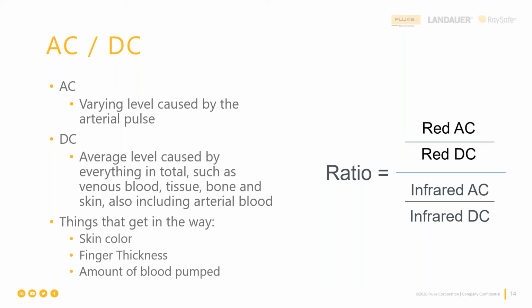It can be patients that have injury, real serious injuries and so forth. Low perfusion also gives pulse oximetry a difficult time getting a valid and complete measurement. And so these are some of the things that get in the way of the doctor or the nurse who's trying to use the measurements from the pulse oximeter, because it's non-invasive. So what do they do clinically?